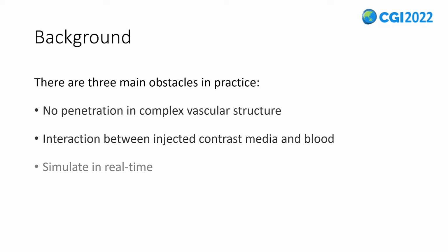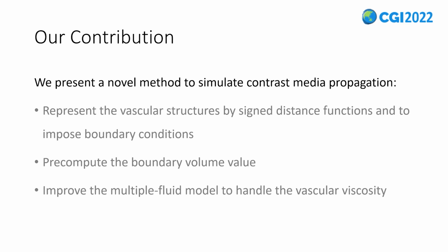Secondly, the diffusion of the injected contrast media is affected by blood flow, so it is infeasible to consider the contrast media diffusion in isolation. Finally, the angiography process is displayed on the monitor in real time, so the algorithm should guarantee real time, which has a high requirement for algorithm efficiency.